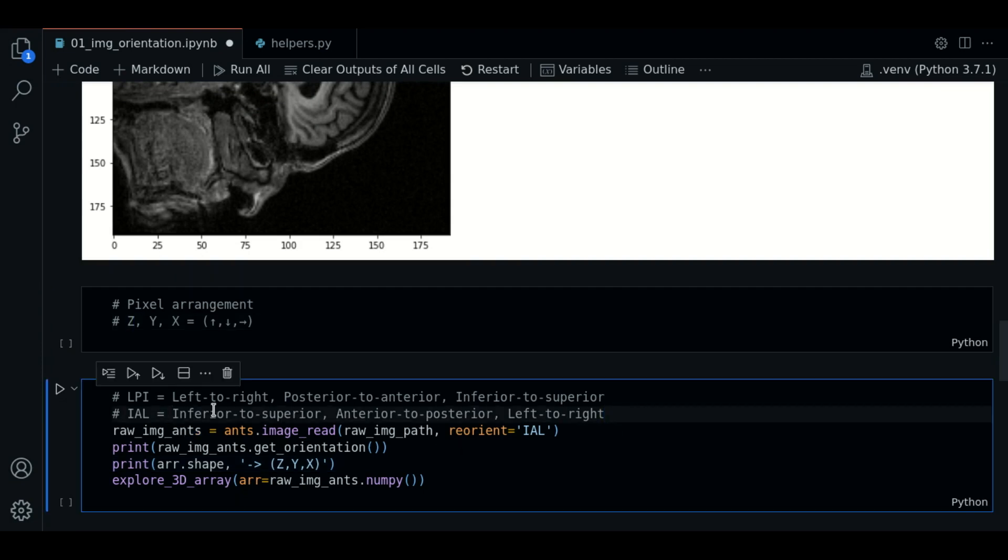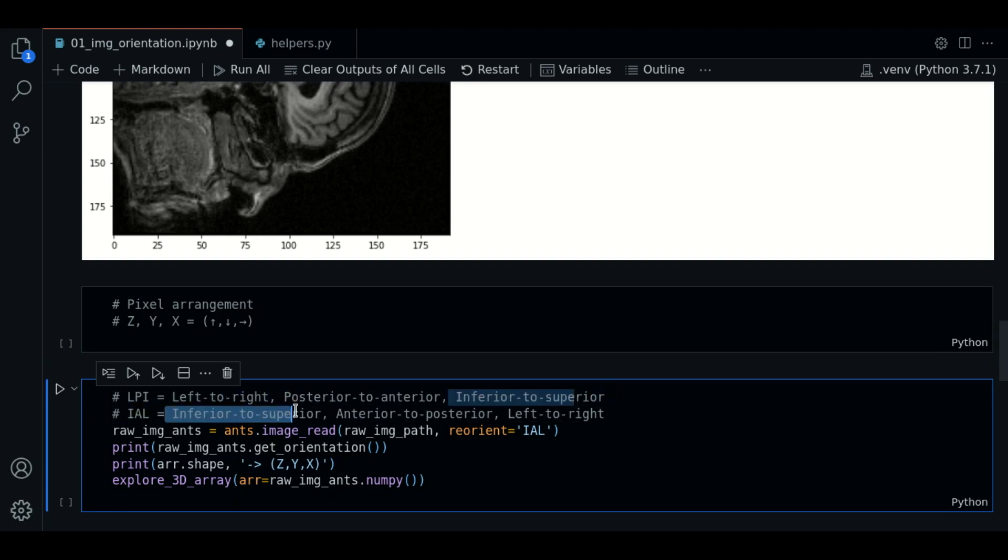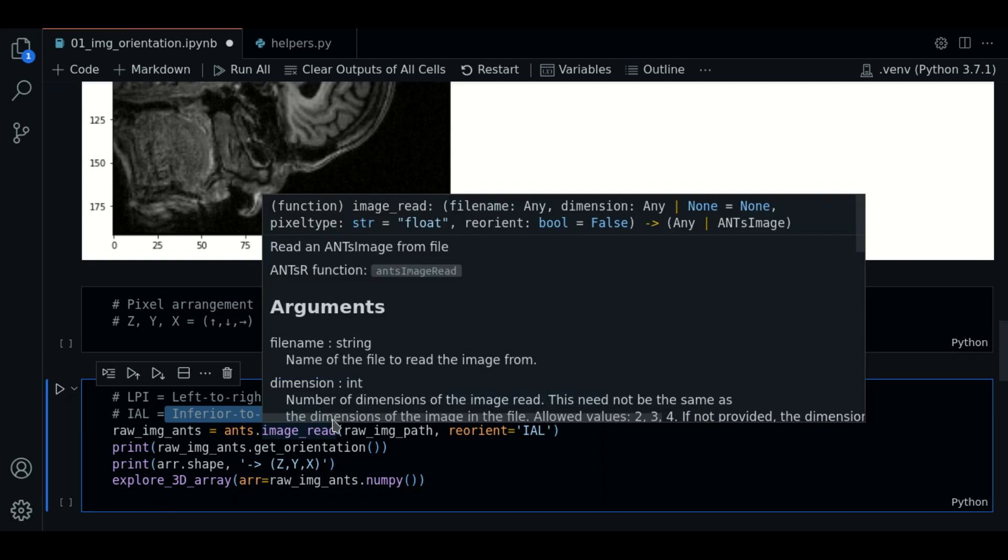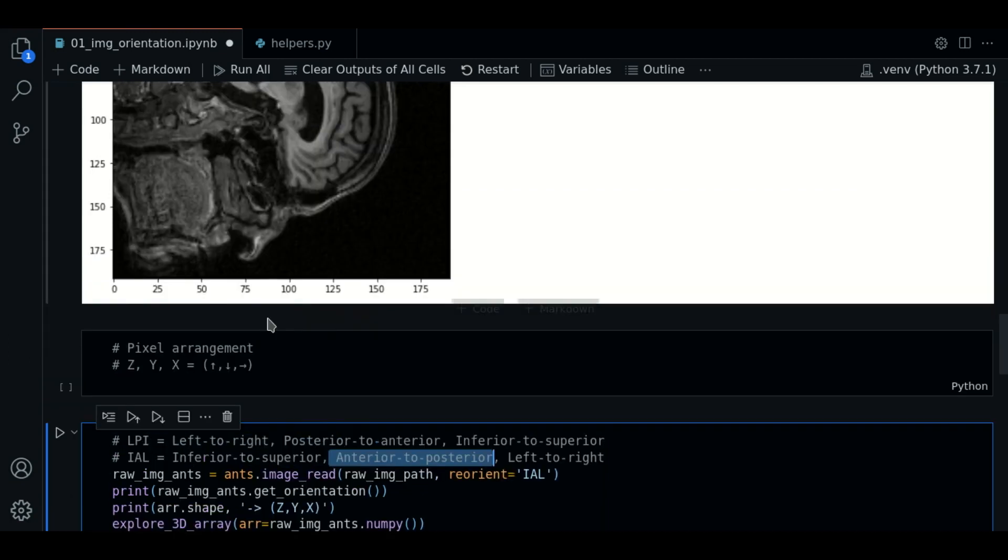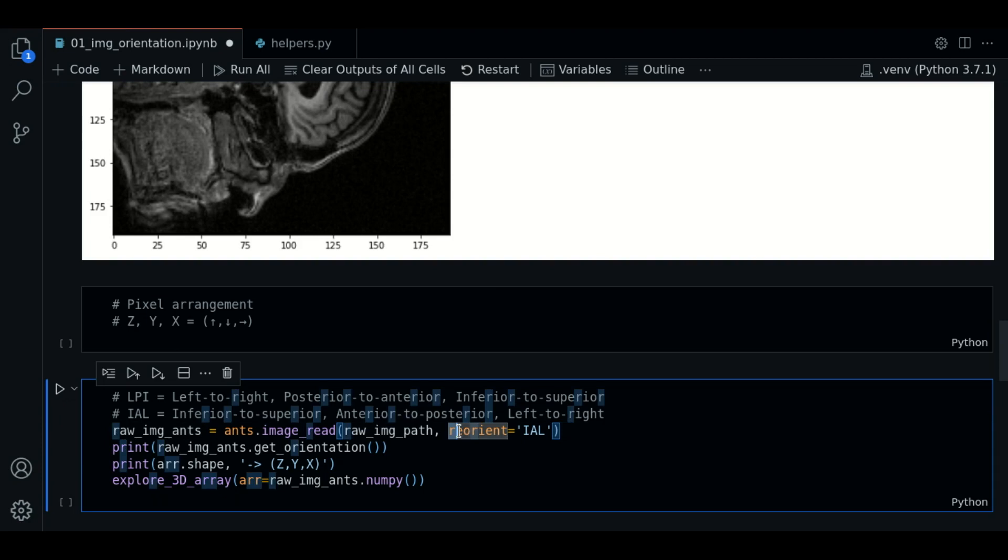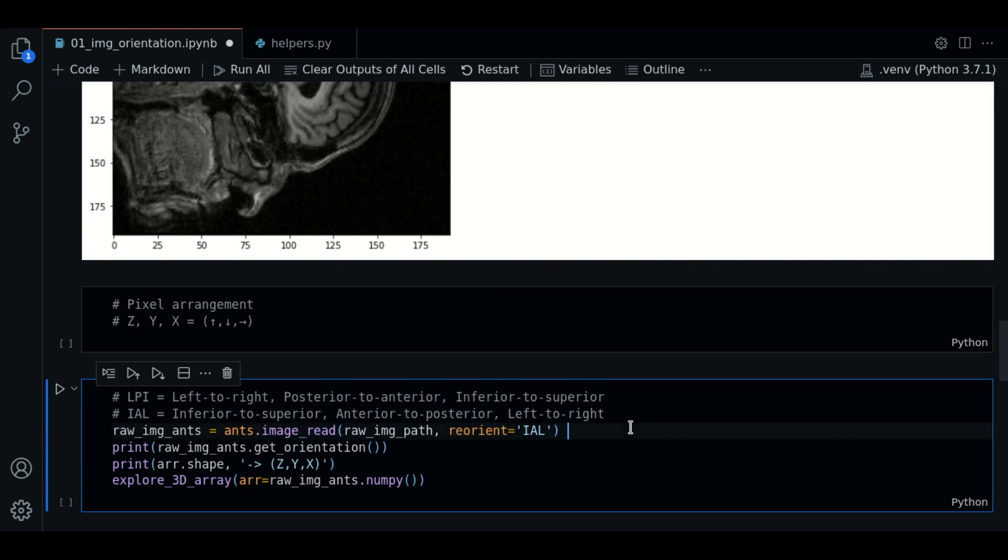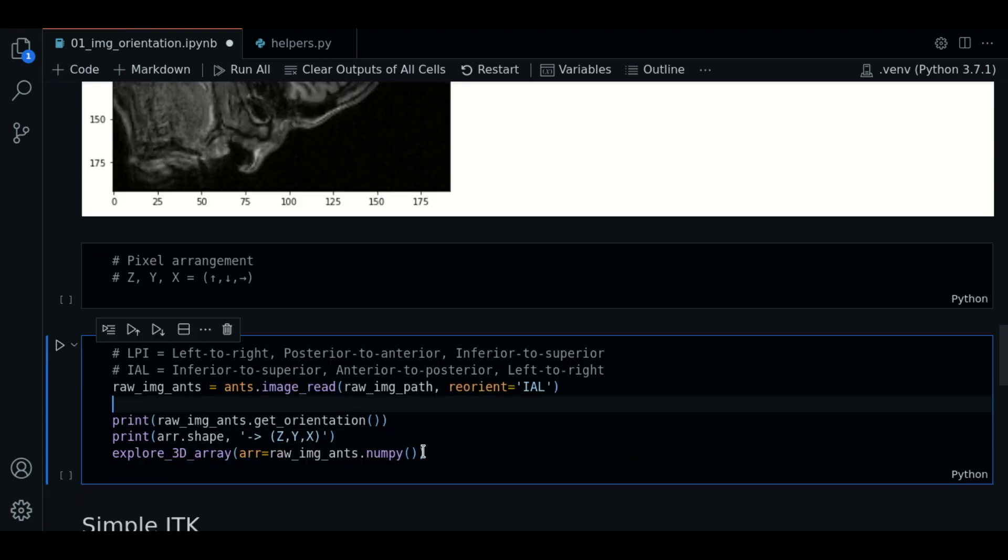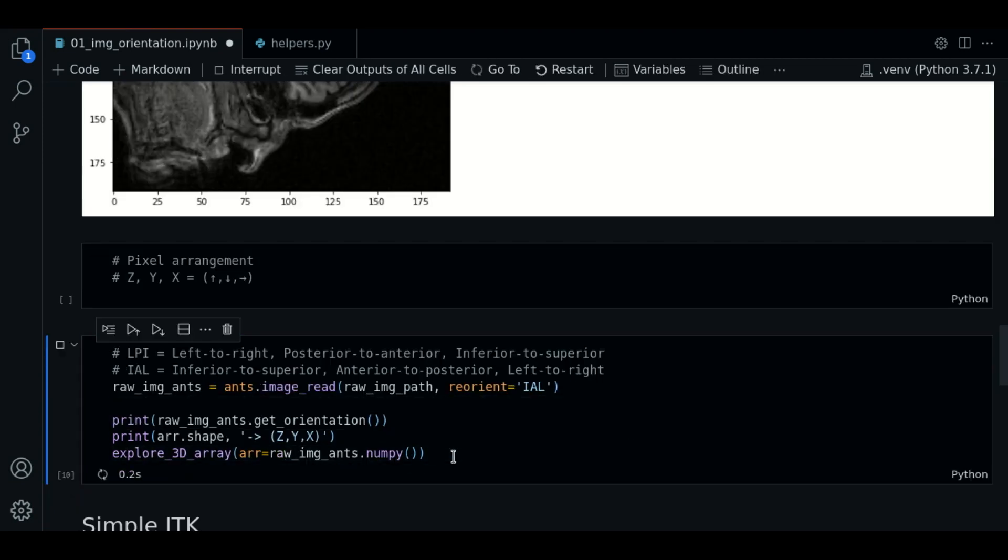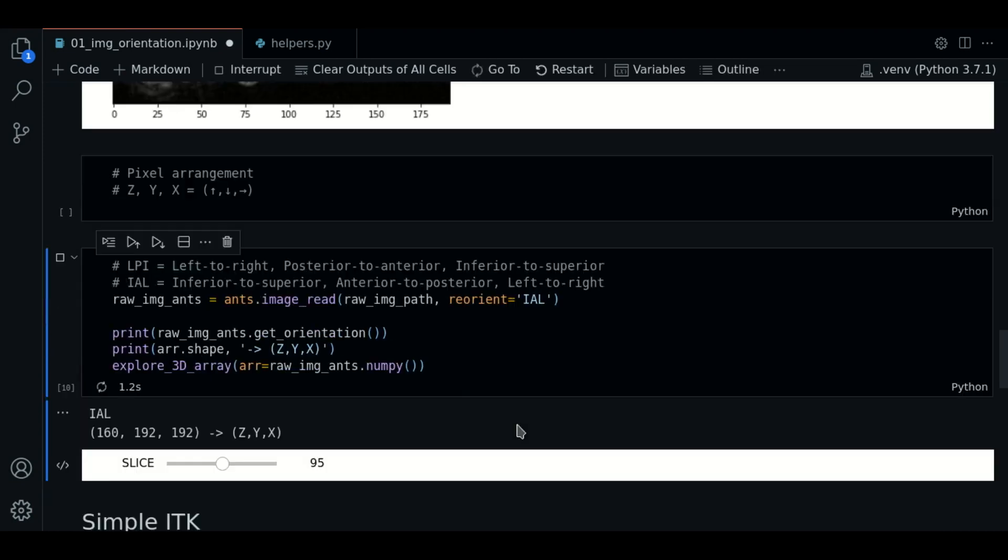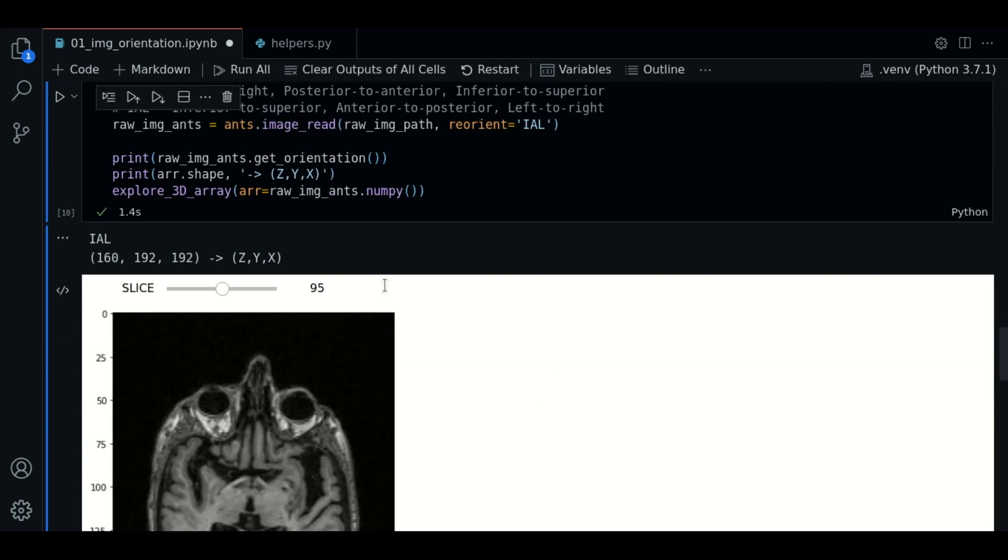Let's try another. IAL for example. This string will arrange the pixels from inferior to superior in the first axis, anterior to posterior in the second axis, and left to right in the third axis. We must use the reorient parameter when loading the image to define the orientation string we want. We will print the same info as before. And let's see.